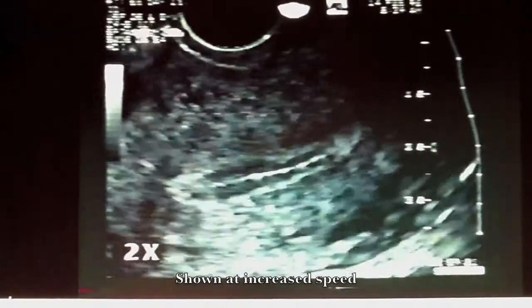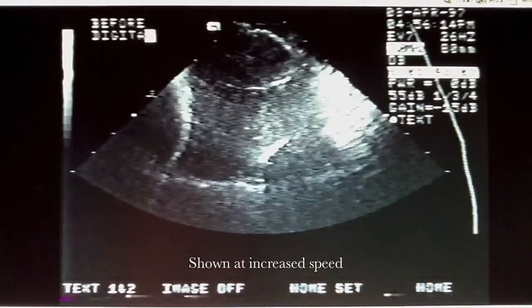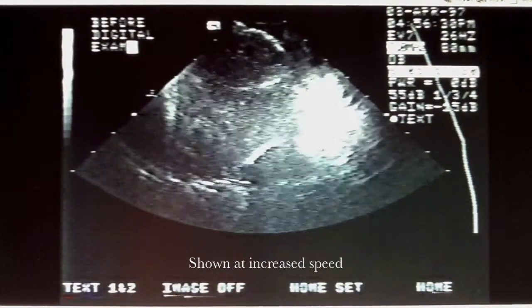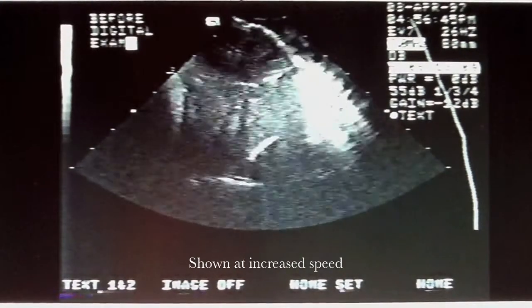In the second patient, who's a 28-year-old colleague of ours at the University of Colorado, she's 38 weeks pregnant and has an intact mucus plug, and she's having some uterine activity, but not labor. But clearly there's no rupture of membranes, and the mucus plug is intact. You'll see the ultrasound contrast media in the top of the vagina, and then within moments it goes up the side of the cervix and enters the lower uterine segment.